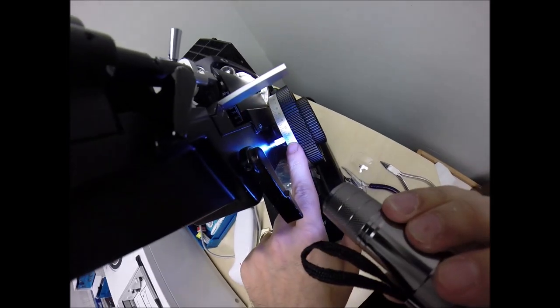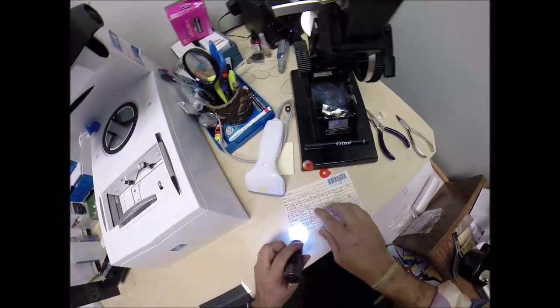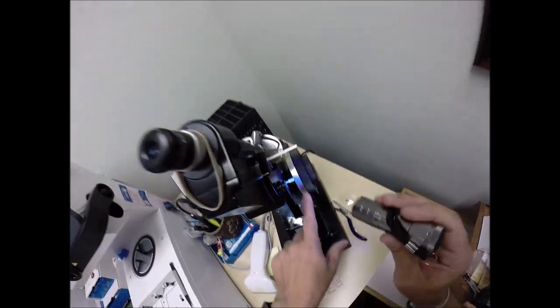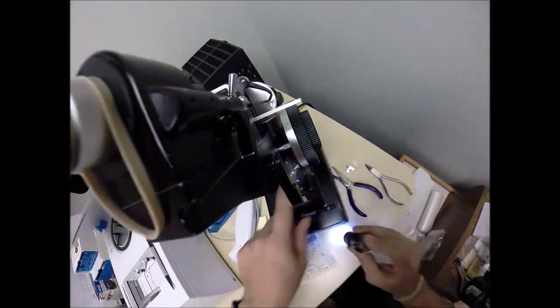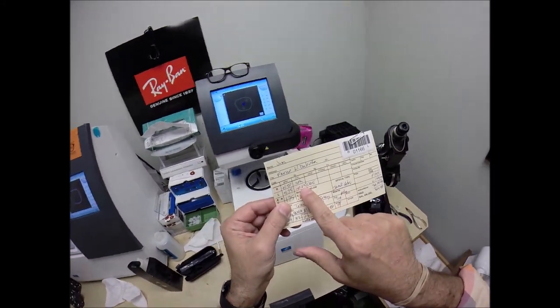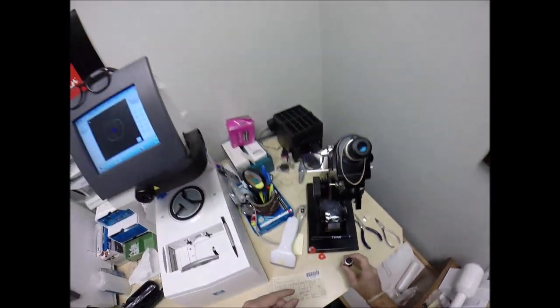I'm getting plus 175, one, one and a quarter, 150, 175. Now you have a quarter step of astigmatism. Let's check for that. We end up back down at 150. Why is that? If you had $1.75 and then loaned 25 cents to somebody, you would have $1.50. That's where we're at, $1.50 in the black, in the plus.